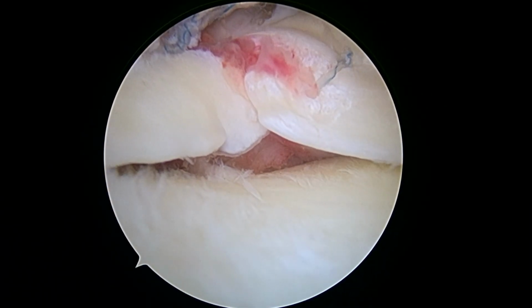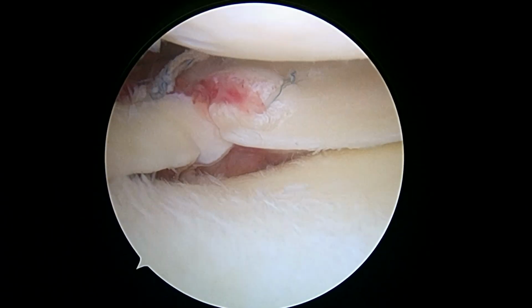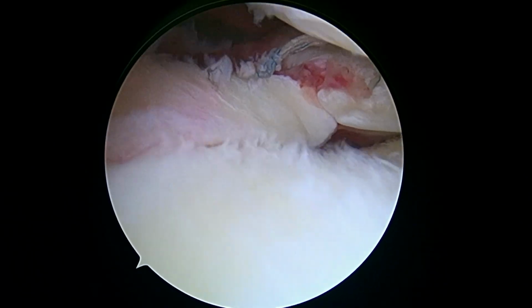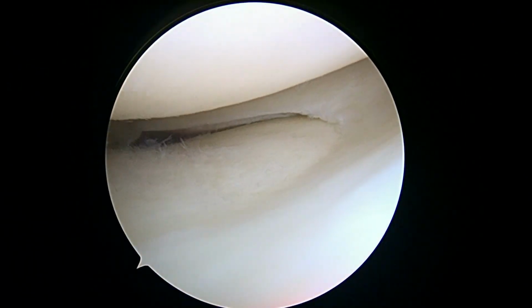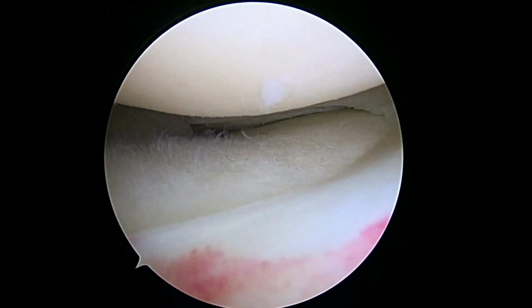Again, that's our final construct. As we straighten the knee out, gotcha. It's stable. We've already ranged the knee, and that's stable. That meniscus isn't going anywhere. So again, I'm happy with that. Pause.